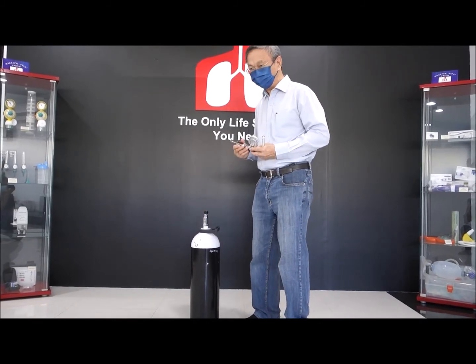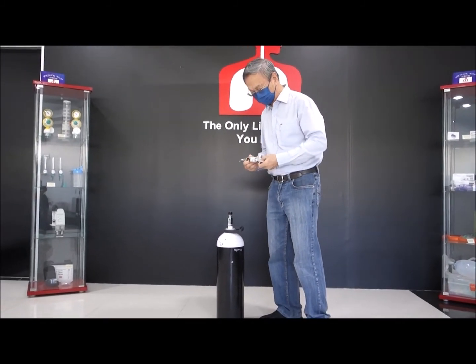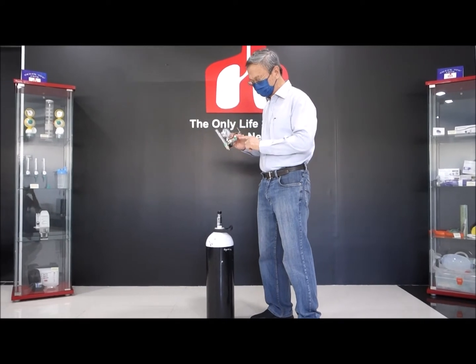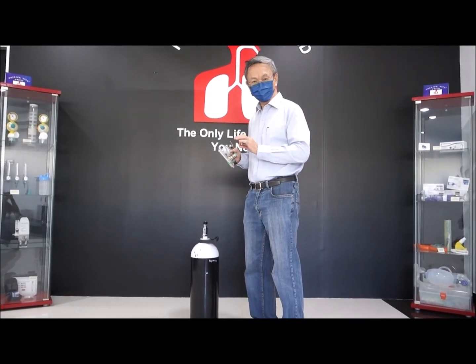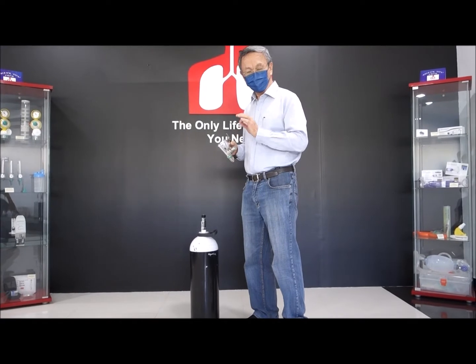Very important to remember is, as with all the regulators, it's stated that we don't use oil. So be very careful, no oil.